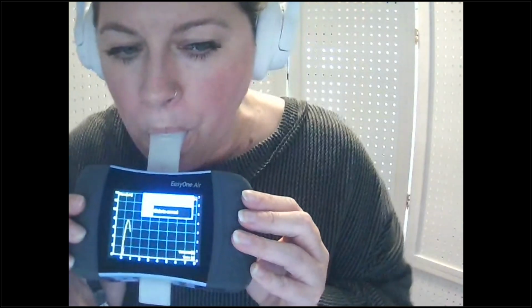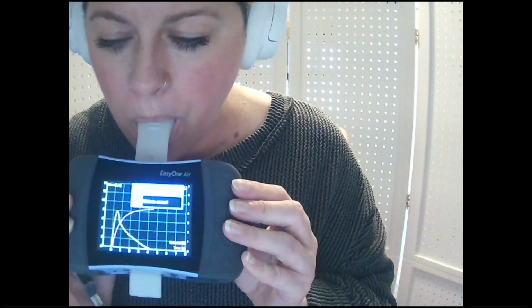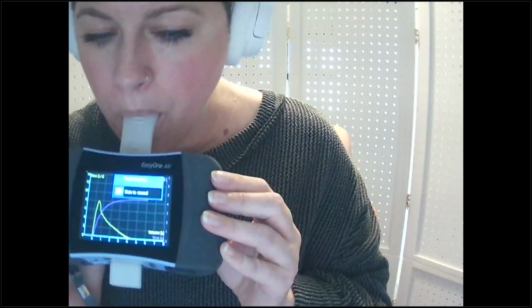I am adding a trial to the test that I had already performed on this device earlier. So this should be my third green trial. All right, I got those happy beeps and it is telling me that the session is complete so that I can go ahead and end the test.